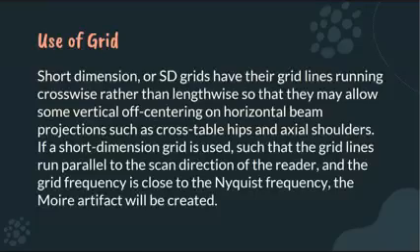Aliasing artifact. So, it is Moiré artifact when it is in the film screen system, but when the image is digitized, it is called aliasing artifact. Aliasing. It is due to the Nyquist frequency, the frequency at which the CR reader scans the plate line by line, interacting with the grid strips which also have a frequency.